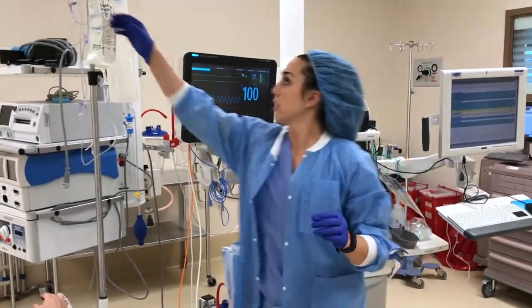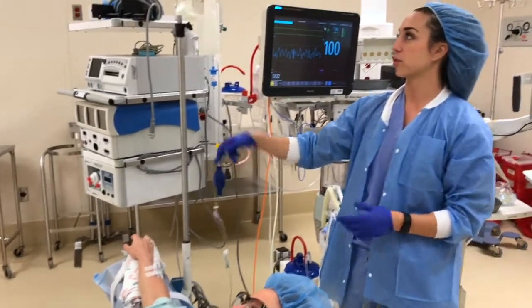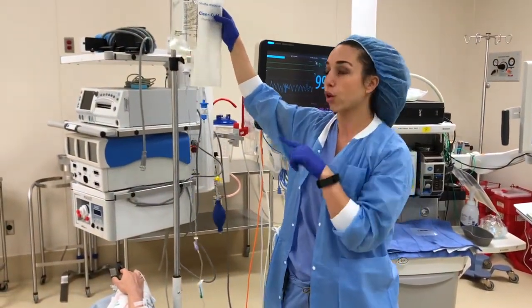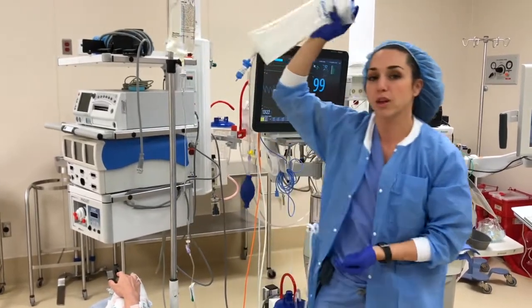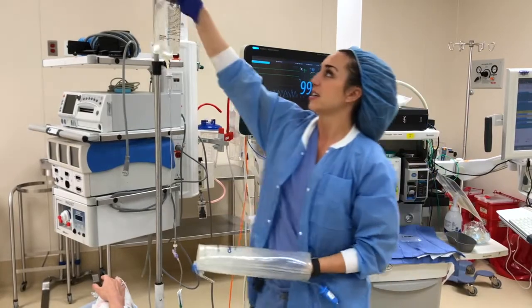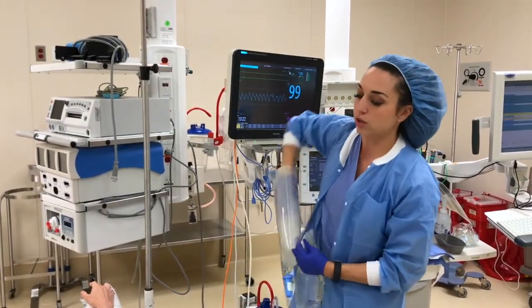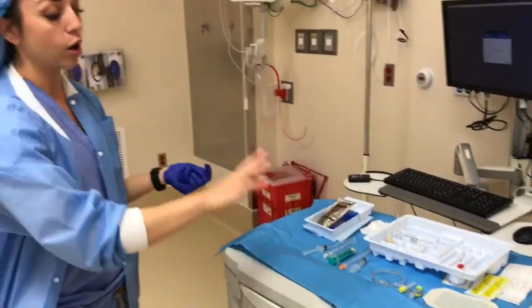We will also go ahead and hook up our IV. Make sure that your IV runs freely. Ensure that your IV runs freely before putting it in a pressure bag. There's nothing worse than applying pressure to an infiltrated IV. That would be no bueno. So once you know that your IV is running freely, then you may pressurize it.